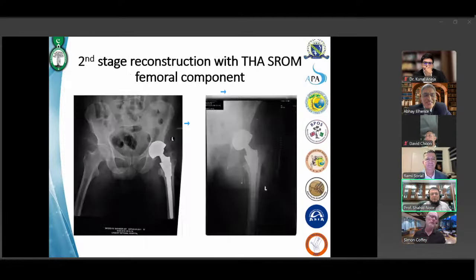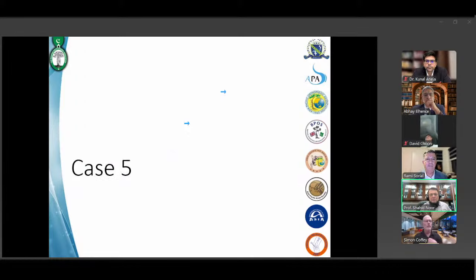Good. So we use uncemented dual mobility on the acetabular side, and on the femur side, because of the calcar loss, we use an S-ROM type of implant, mobilized full weight bearing, and she's doing pretty good. Yep, that's a good case.